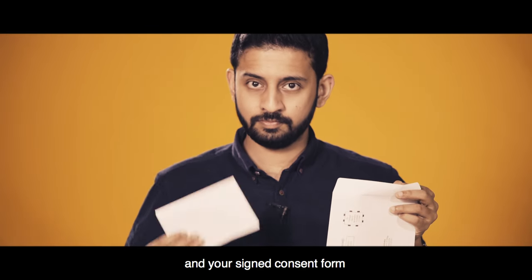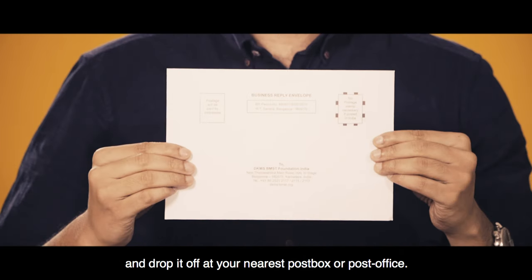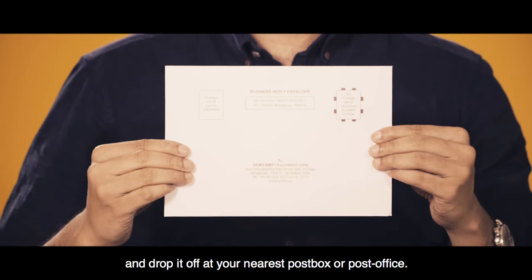Finally, put the swab envelope and your signed consent form into the enclosed prepaid postage envelope, and drop it off at your nearest post box or post office.